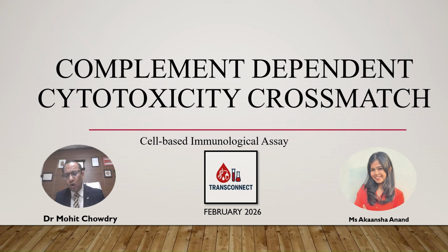And secondly, because you can actually differentiate between an auto crossmatch and an allo crossmatch in this, which is equally important. We know that auto antibodies are not deterrent to the graft, so even if you have auto antibodies, you can still go ahead with the transplant. So that is another part of it.